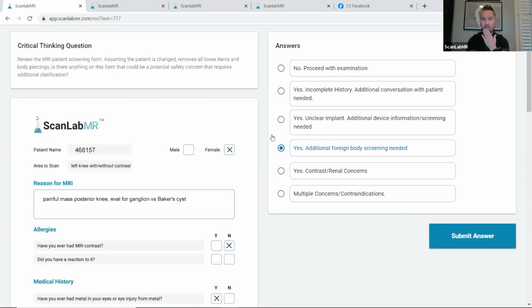Toby, what do you think? Any questions so far? No. I think it's fantastic that even before you get into the simulator, you're walking people through the normal technologist radiographer steps in terms of clarifying concerns with the patient. I think it's great. Good, excellent.